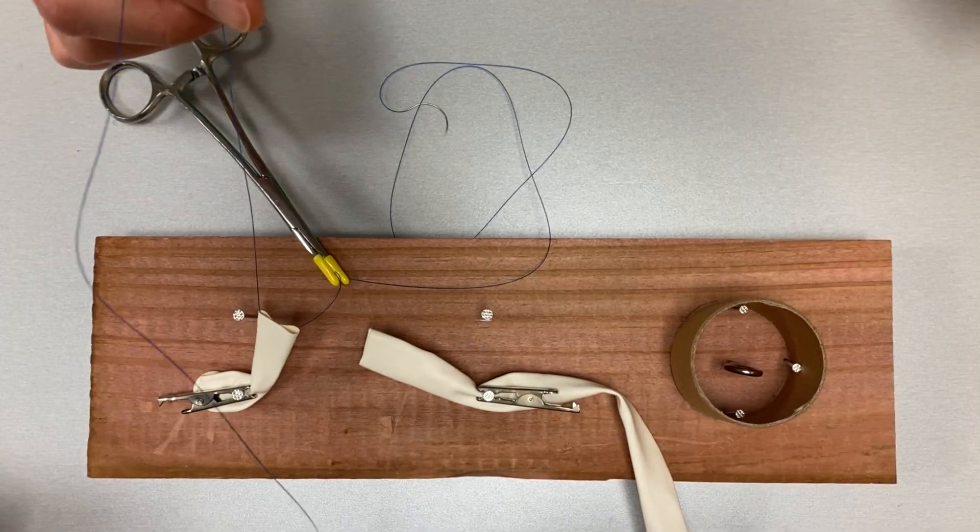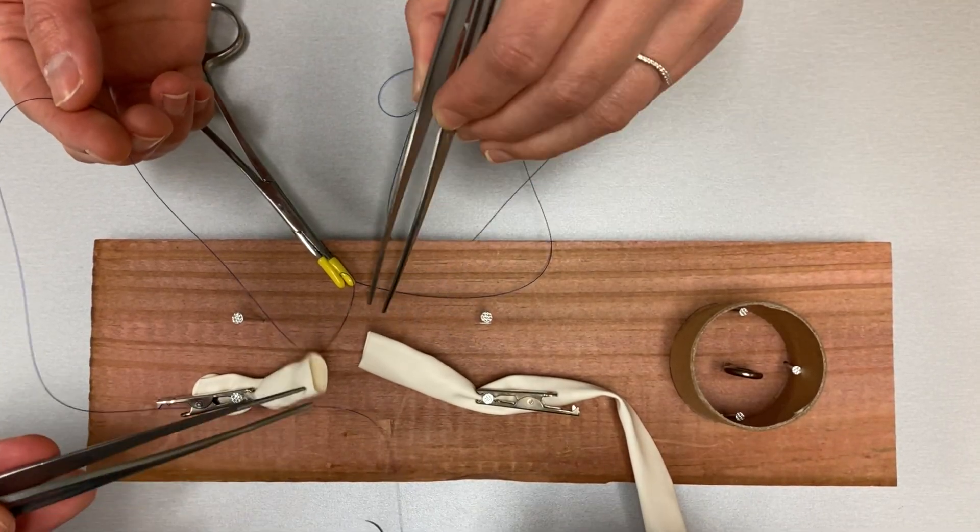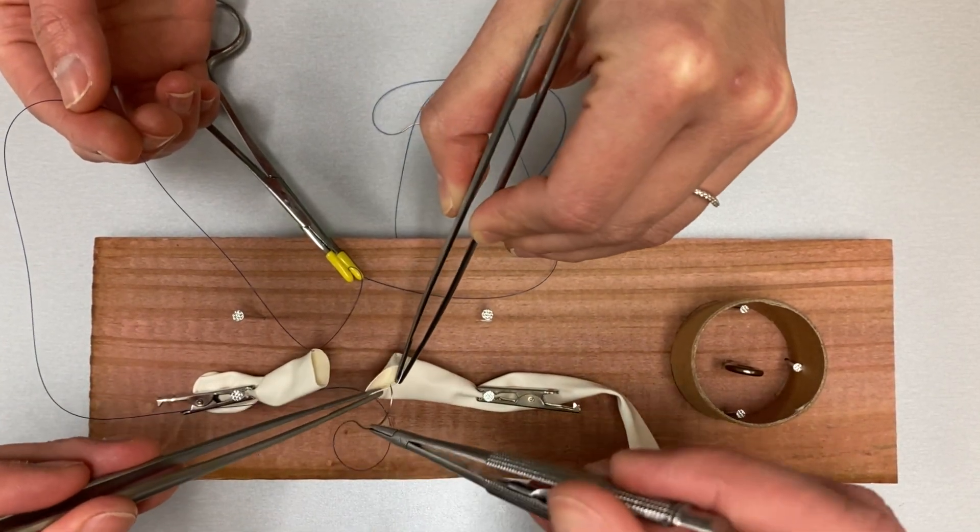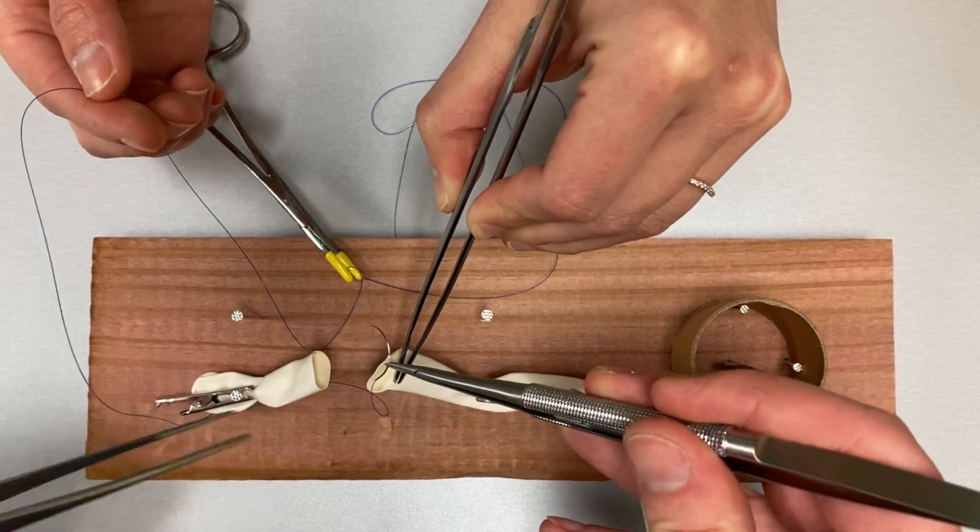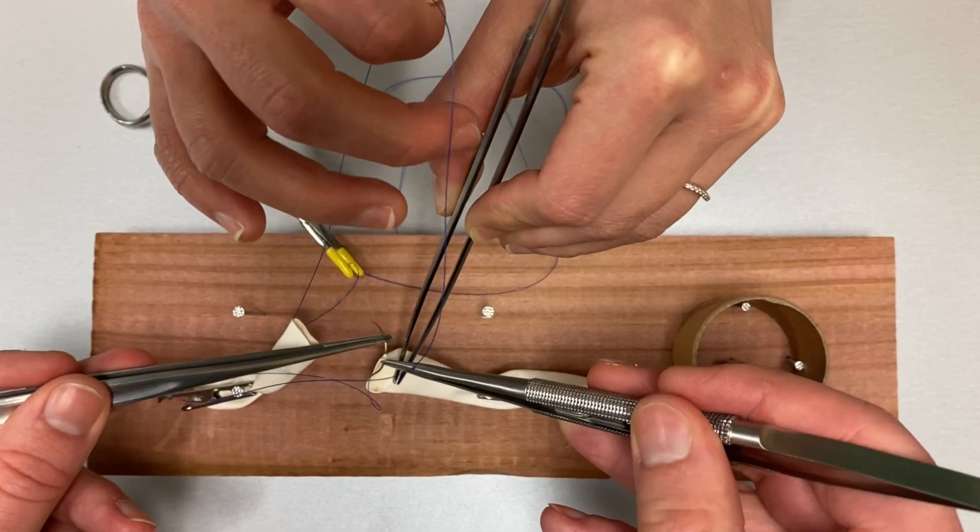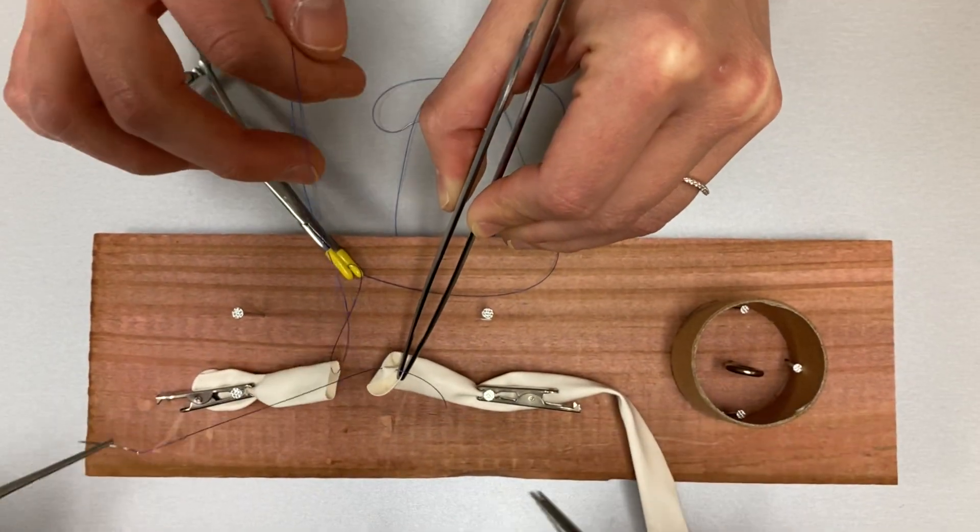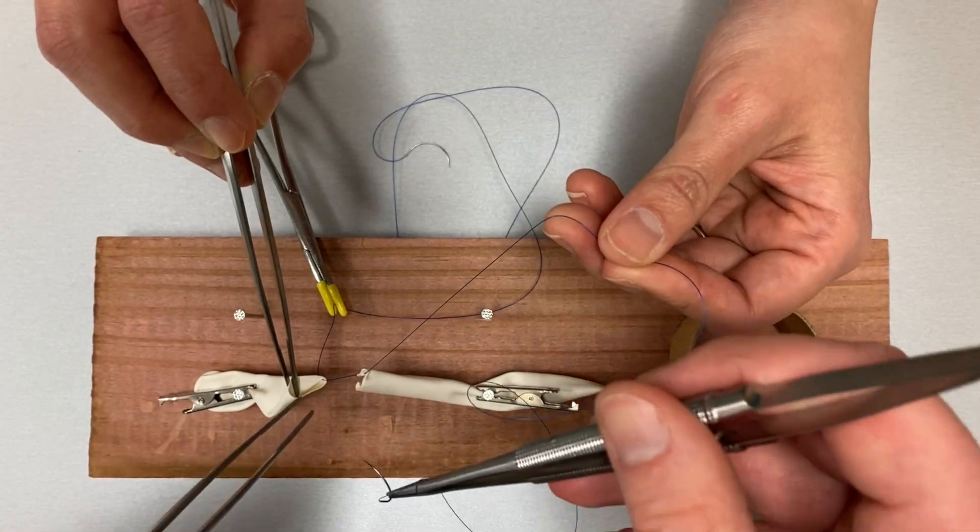Your assistant can now begin to follow you to provide tension. Take your next bite from inside to out at the 9 o'clock position at the vessel end to the operator's right. Be sure to grab the needle from below the loop of suture to avoid locking your stitch.